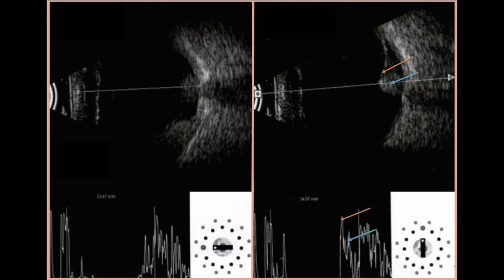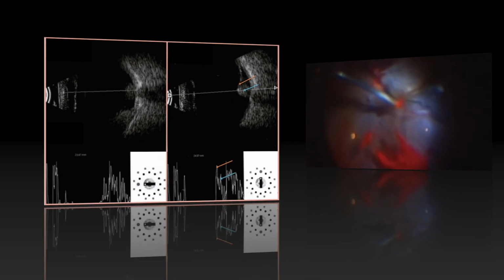Axial horizontal scan showed relatively anechoic anterior segment and vitreous face with a hyperechoic lesion over the disc and temporal to the disc with low to medium reflective spikes, whereas axial vertical scan revealed medium to high membranous reflective spike with submembranous low reflective spikes, possibly suggestive of retinal detachment with subretinal hemorrhage.